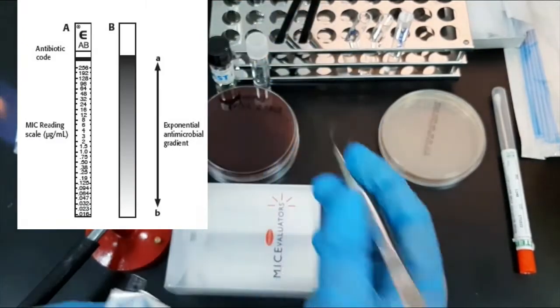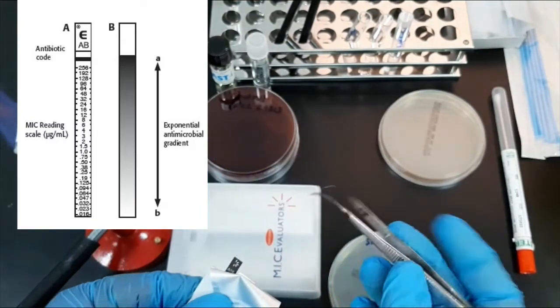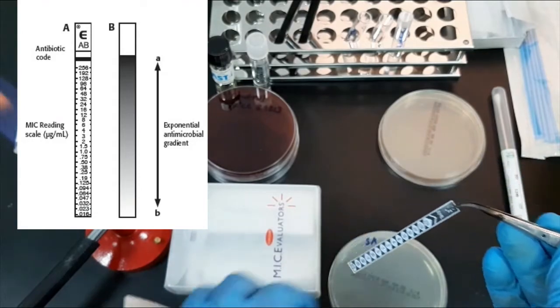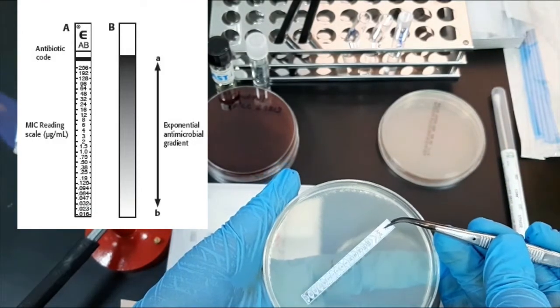With the help of a sterile forcep, hold the end of the strip that shows the antibiotic code. Gently drop the E-strip onto the agar surface with MIC scale facing upwards.